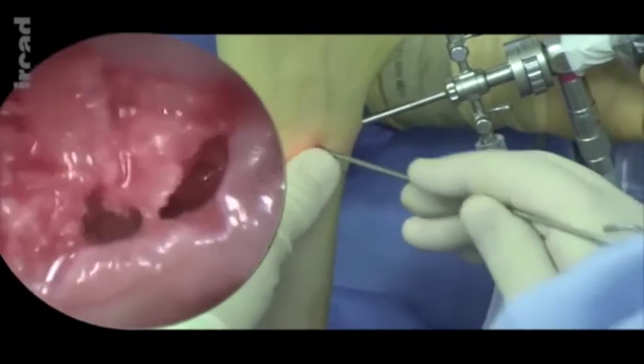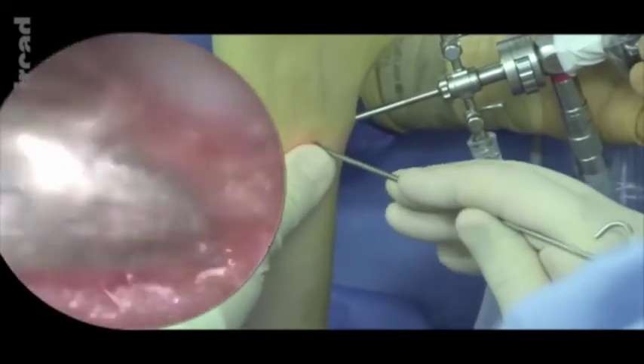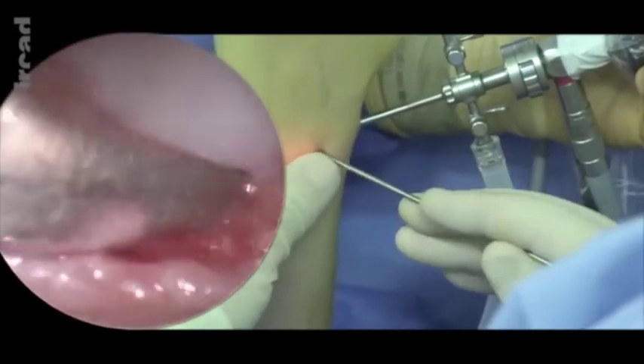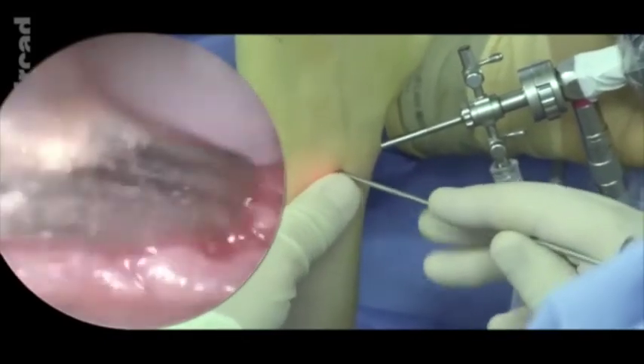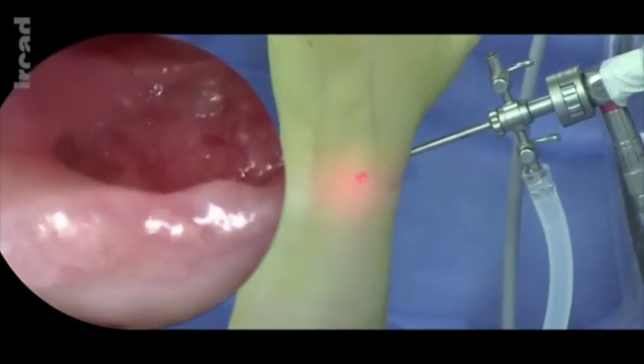The small graft pusher is then used. Sometimes a small spatula may be used to correctly pack in all grafts inside the bone ganglion. When traction is released, the anatomical position of the lunate bone will come opposite to the radius and prevent any exiting of the bone grafts, which are now adequately packed. The bone ganglion is now filled in.